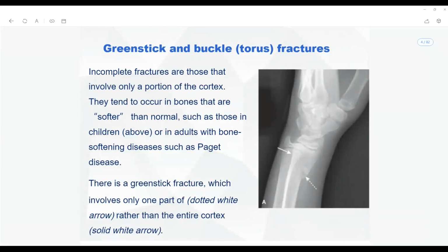4 images. It is expensive, but still you have to write it no matter what, because it's not about making money here. Don't ignore, guys. You are not going to make money here, but it is actually going to give you a lot of information. When you are looking at the bones, you cannot look at the bones in only one view.